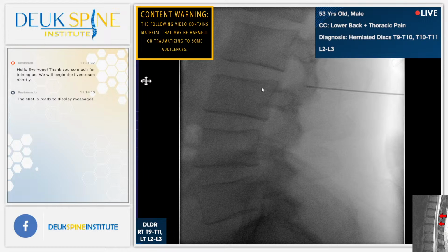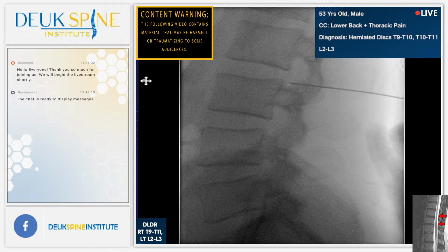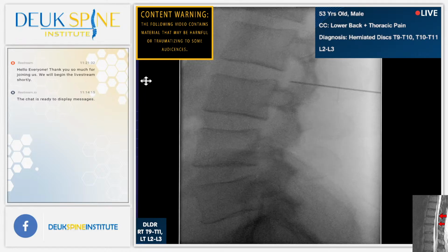5, 4, 3, 2. Everyone agrees that's 2-3. We're going to come in low within the foramen. Shot. I'm coming around the facet right now, and we're going to access the disc. Shot. I'm right at the back of the bone there. I want to be a little bit higher. Shot. I'm adjusting my trajectory just a little bit. Shot. Whoa, shot. So that's breathing that did that. Shot.